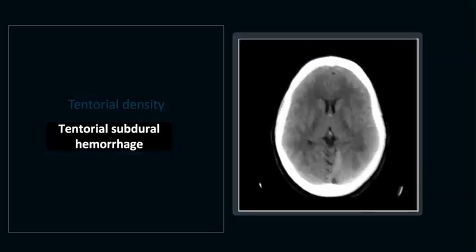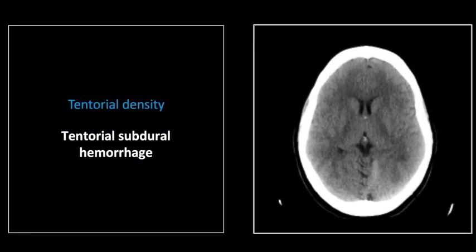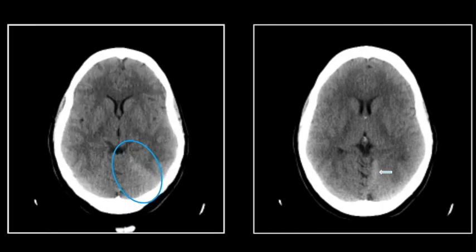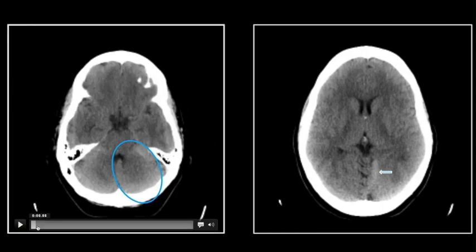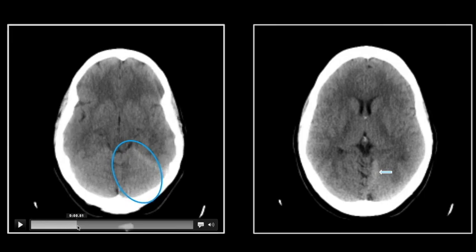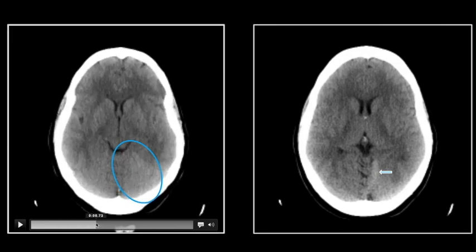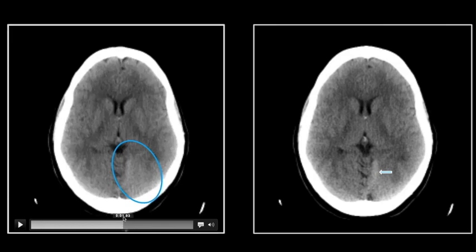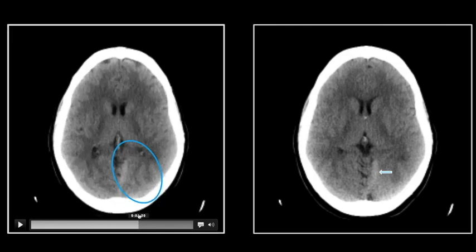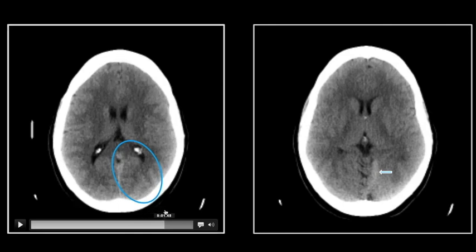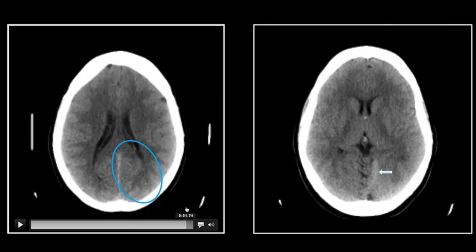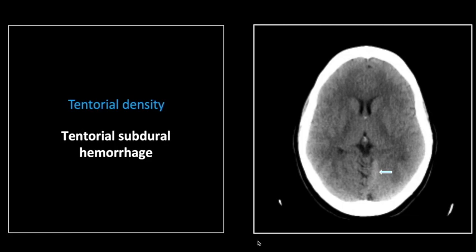Our next case is another typical location for subdural hemorrhage, and that's along the tentorium. It's symmetry that really helps you here. There is a nice asymmetric thickening and increased density in the left tentorium compared to the right. That again is a typical tentorial subdural hemorrhage.